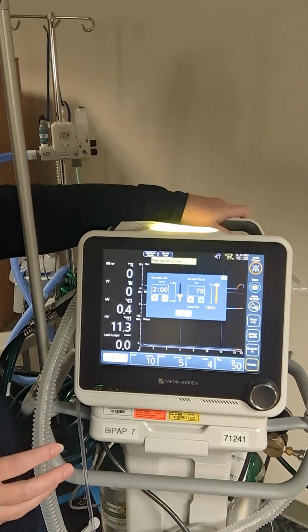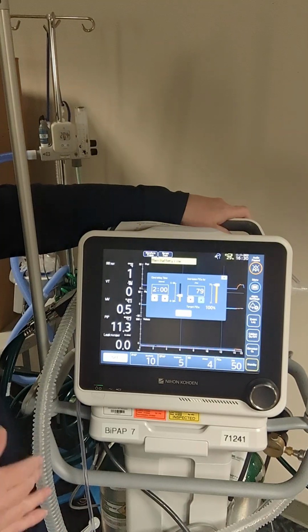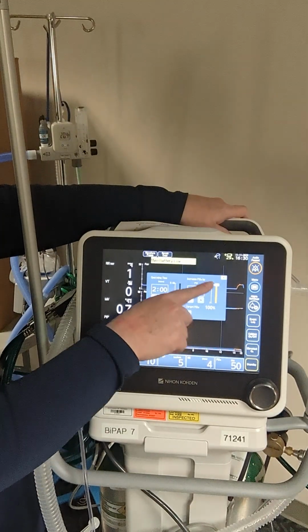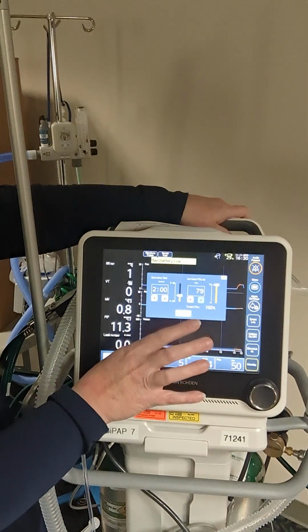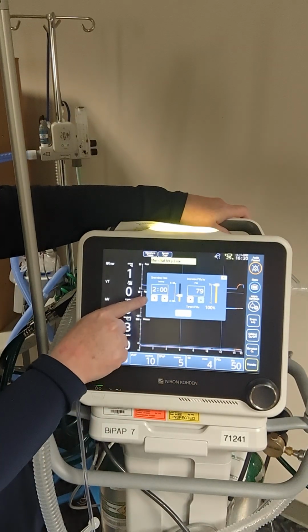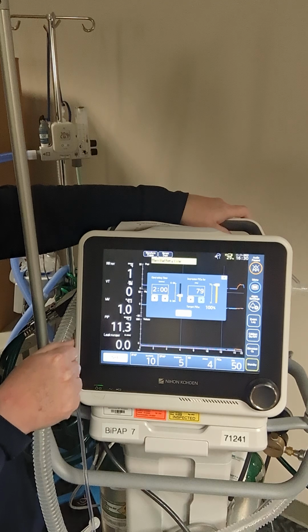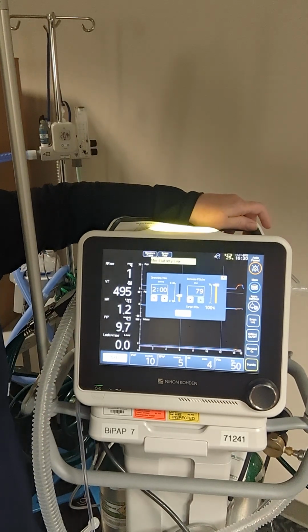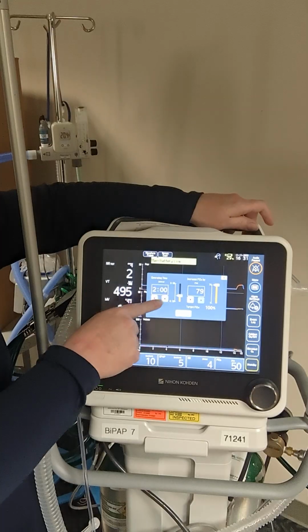Well, I had to stop and think. 21 plus 79 gives us our 100%. So this will always be 100% as a default setting. And then we also have 2 minutes of hyperoxygenation, so that 100% oxygen we're delivering will last for 2 minutes.